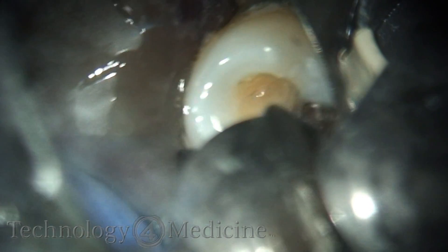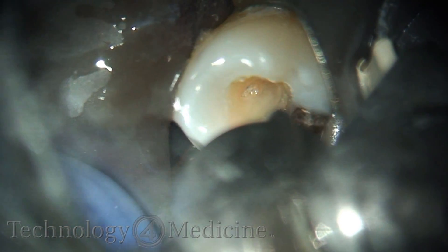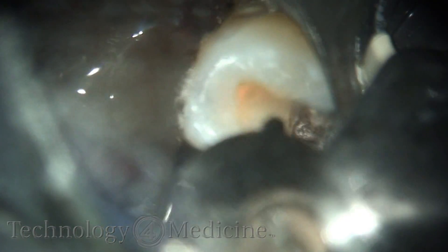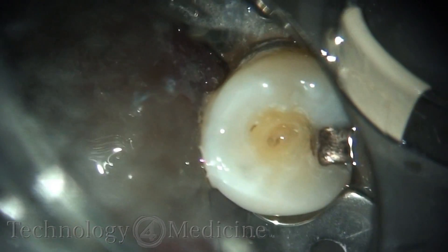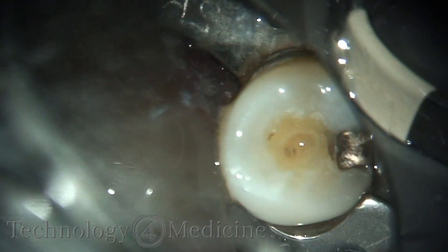You can see I'm opening up my access using the R02 tipless handpiece. You can also use the R14 tipped handpiece if you so desire. I'm exposing the pulp chamber, and you'll note there's virtually zero vital tissue here. This tooth was non-vital.